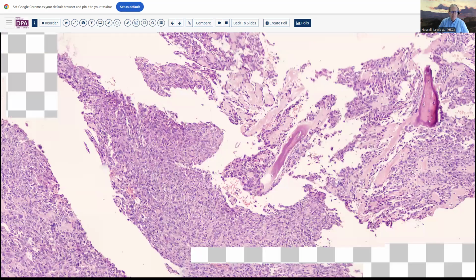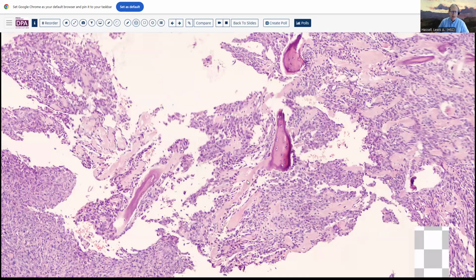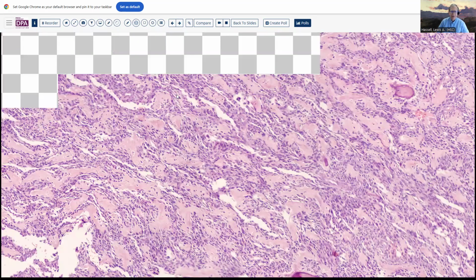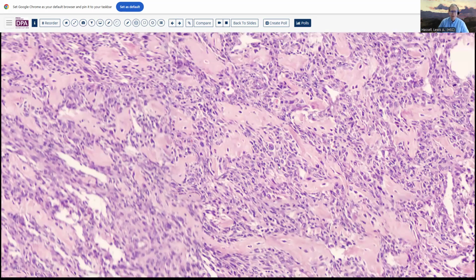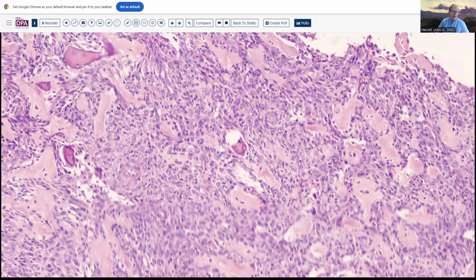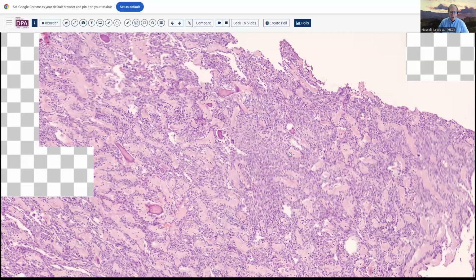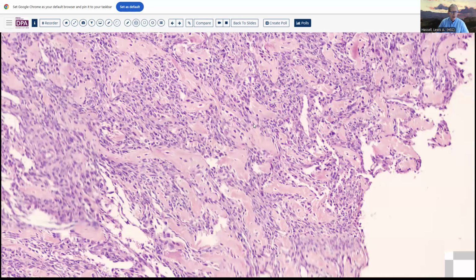Here we see, again, a bit more of this more reactive type of bone formation. And again, I think a polarized light exam would be very helpful and instructive in this situation. Here's maybe a little bit of giant cell or pleomorphism to the lesion. And here a few of the vascular structures. Here you see slightly ectatic vessels. And again here, some of this ectatic vessel appearance.